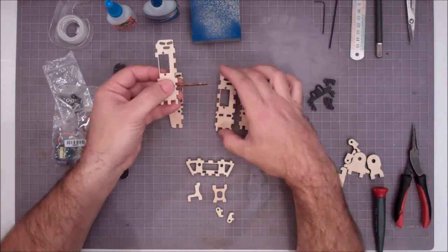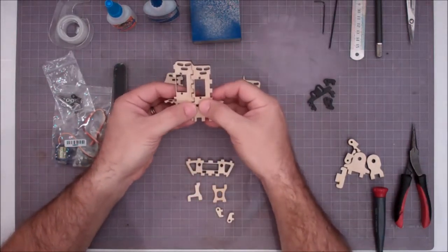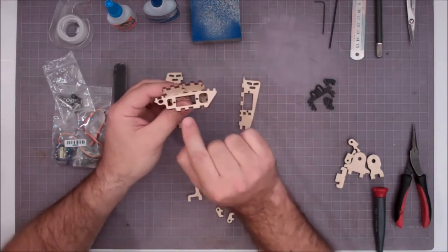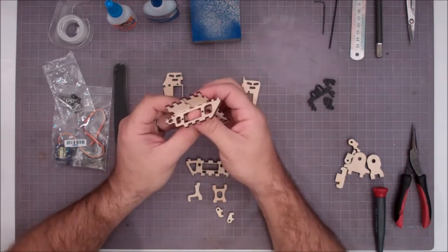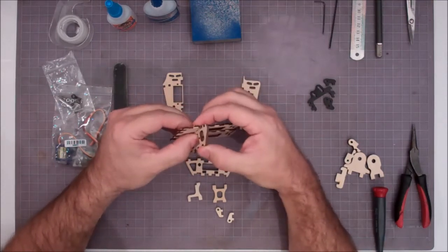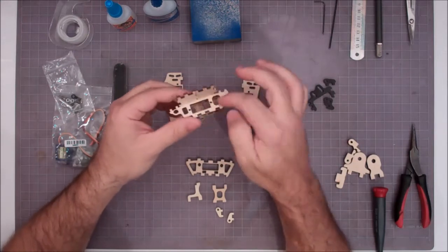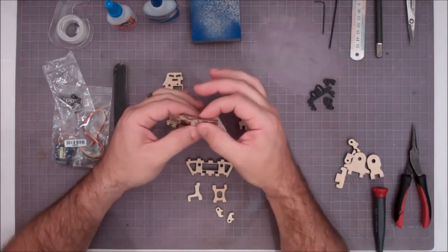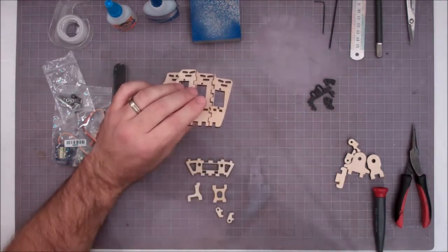So I like to put that plate on, and then I'll switch to the one next to it. And now basically what you want to do is push these plates straight down onto each part. One key thing when putting these plates on this little piece, you do not want to squeeze out here. If you squeeze hard right here, you'll snap off this lower brace. So what I do is I'll reach my finger in the thumb screw hole and squeeze there very gently, or you can squeeze out on the edges. But basically what you're doing is you're just trying to work these plates down, never squeezing there, until they sit flush. You want to look along this line right here and make sure you don't see a gap. Now you'll also notice that you just kind of have to push the plates together to line them up here. So that one's on, and you just want to work one at a time because they're all at different angles, so you can't push them all together at once.